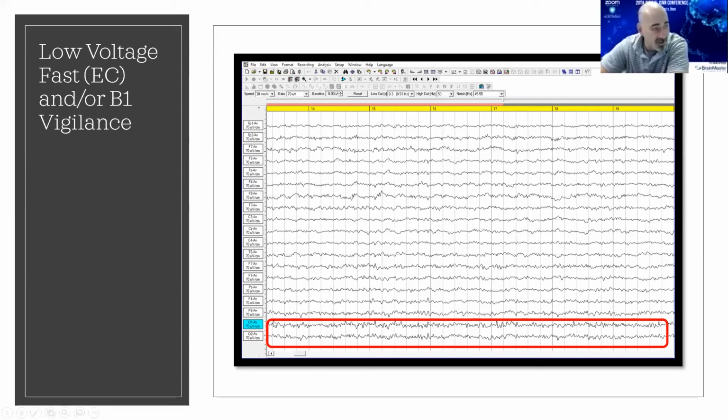And if we look at this down in here, we can see that this is low voltage, it's desynchronized. There's not a tremendous amount of rhythmic activity. There's little bursts of things, but they're generally a bit faster. We look down here in the occipital region and we come along. There's actually 1, 2, 3, 4, that's about 20 hertz. We get in here 1, 2, 3, 4, 5, closer to 25.